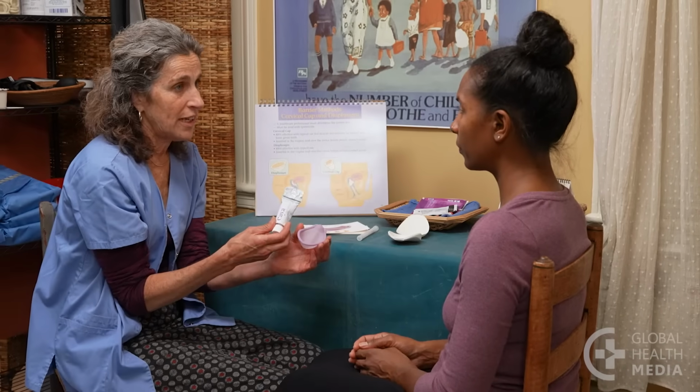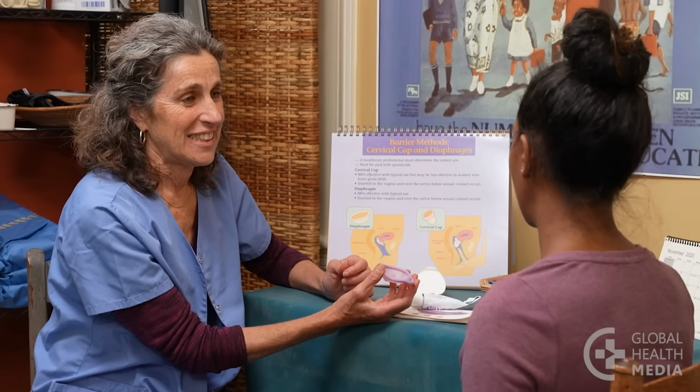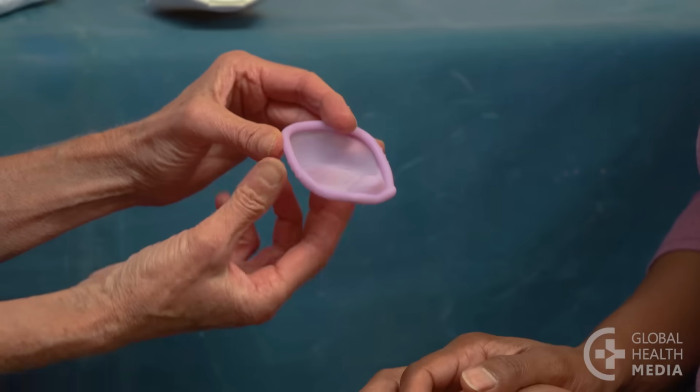You need to use the diaphragm every time you have sex. You can use it with any kind of water-based contraceptive gel. Always put the diaphragm inside you before the penis enters your vagina, no matter what. The contraceptive gel goes in the cup that fits up against your cervix and adds extra protection.